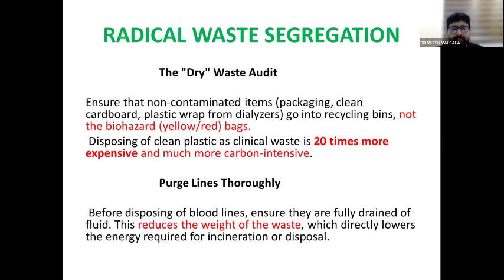So it is important that you purge the lines, the IV lines, everything, without any water left inside. When you dispose of it fully drained, this reduces the weight of the waste, which directly lowers the energy required for incineration or disposal. These two steps, the dry waste audit and purging the lines thoroughly, can be done very easily from tomorrow itself.